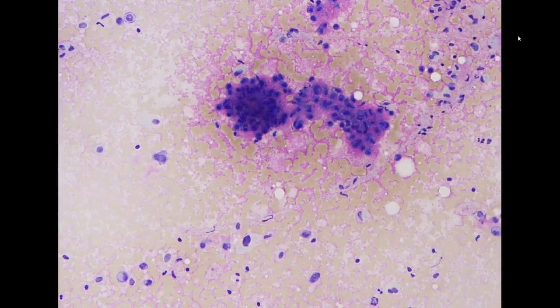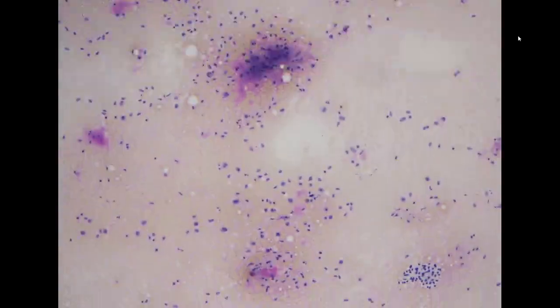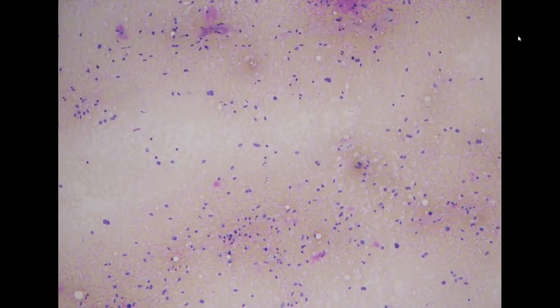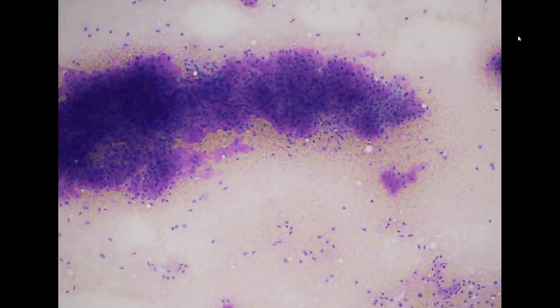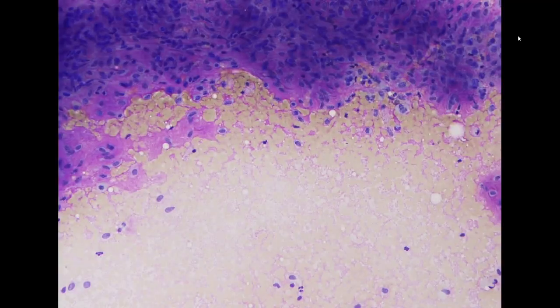So this is very typical for pleomorphic adenoma. And just like what I mentioned before, whenever we see a pleomorphic adenoma, we need to check if there are any cells with cytologic atypia, which would suggest a carcinoma ex pleomorphic adenoma. In this specimen, we do not see any, so this is benign. So we sent it out as a benign pleomorphic adenoma.